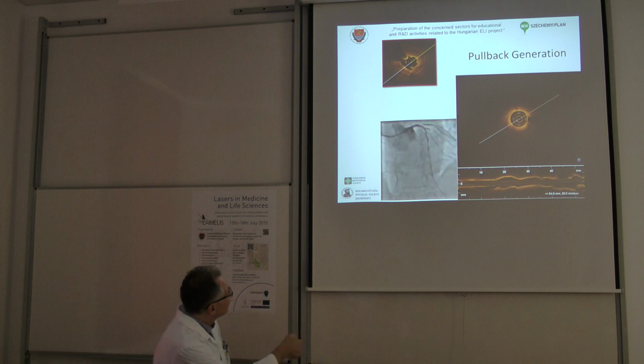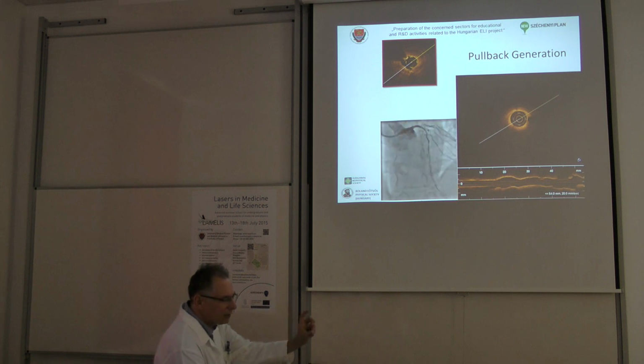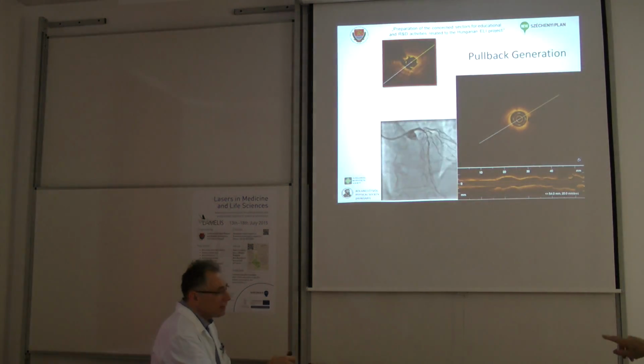Yes, but still it can be seen. There are some markers which show us. Let me see. Yes, so this very tiny spot. So this longer one is the guide wire. This is the very distal 3 or maximum 4.5 centimeter long ending of this guide wire. So this image was 5 centimeters.